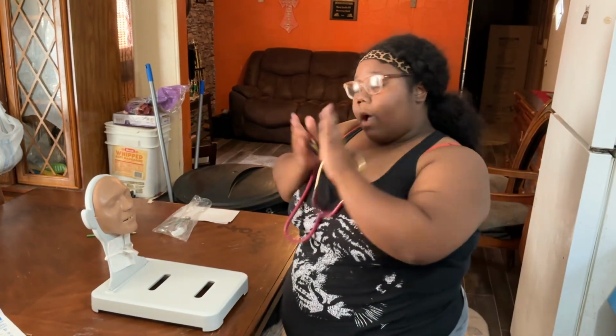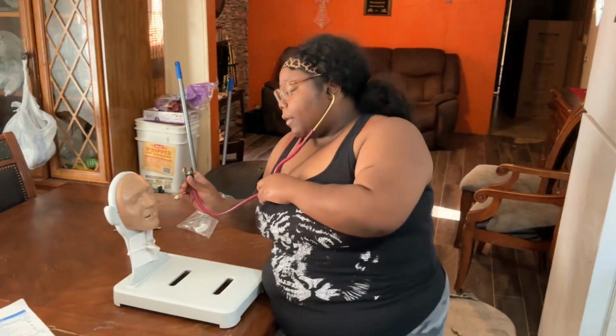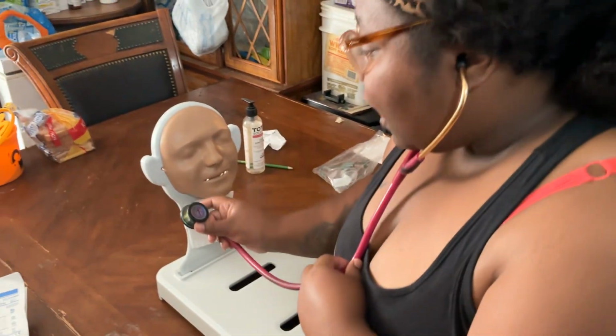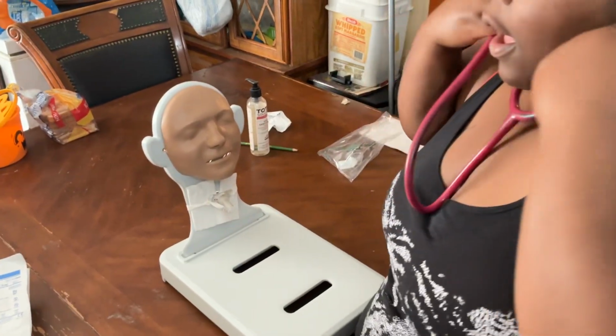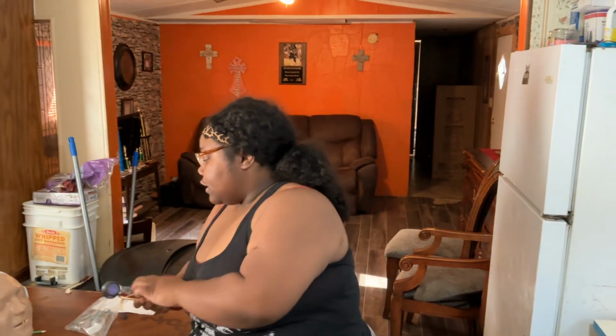All right. This will already have been wiped with alcohol. It is wiped with alcohol already. It's clean for my patient to be used on. So I'm going to go ahead and listen to my patient's lung sounds. I'm going to listen to my right upper lobe, right lower lobe, right middle lobe, left upper lobe, left lower lobe. Alright, I do hear some secretions in there. I hear some congestion. So we're going to go ahead and suction you out, okay?